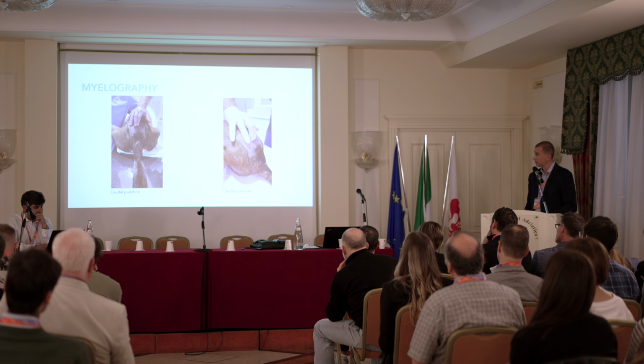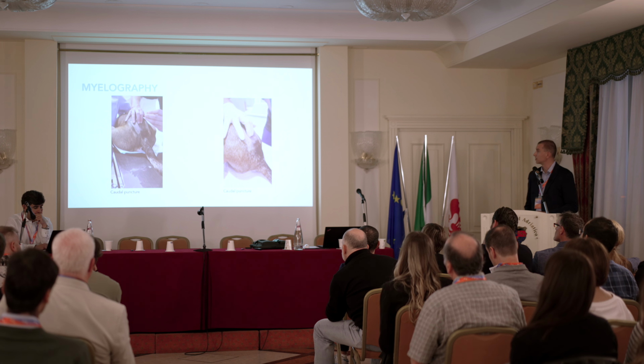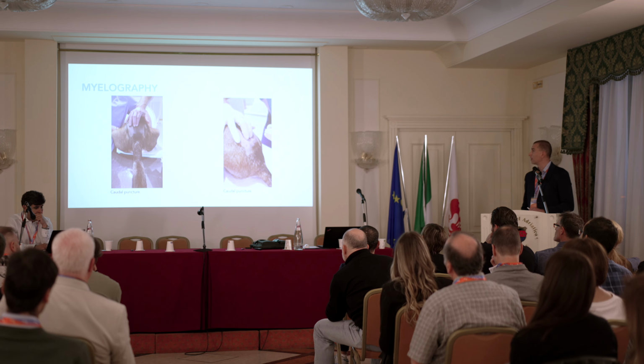So there are other videos of my application. So usually I just palpate the last spinous process and just easily go in.